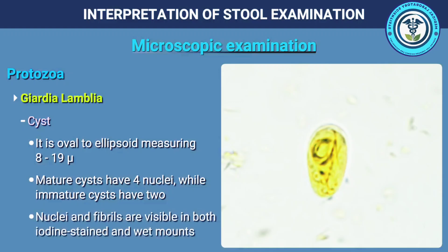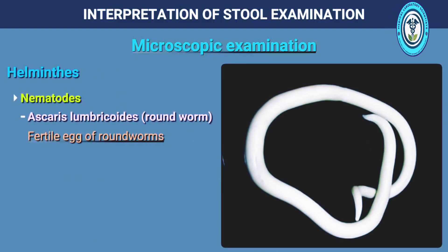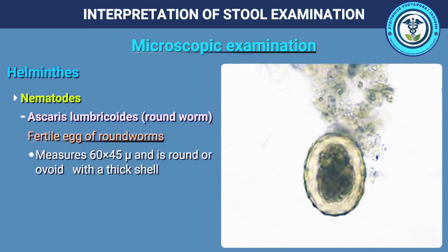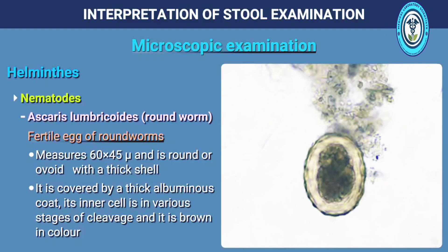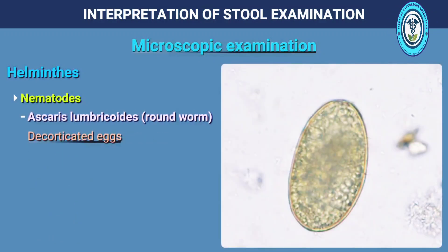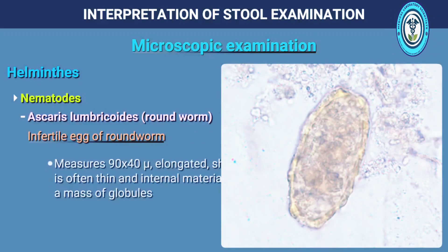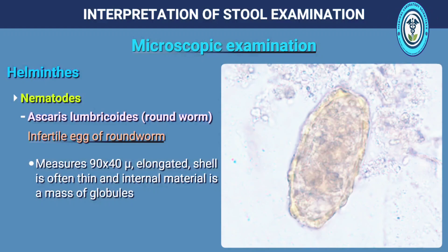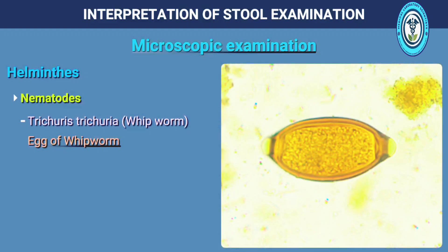Nuclei and fibrils are visible in both iodine-stained and wet mounts. Ascaris lumbricoides (roundworm): the fertile egg measures 60 by 45 microns. It is round or ovoid with a thick shell, covered by a thick albuminous coat. Its inner cell is in various stages of cleavage and it is brown in colour. Decorticated eggs have the albuminous coat lost. The infertile egg measures 90 by 40 microns; it is elongated with a thin shell and its internal material is a mass of globules.